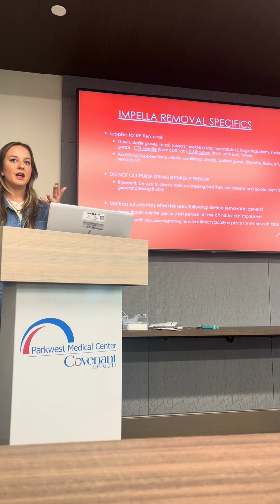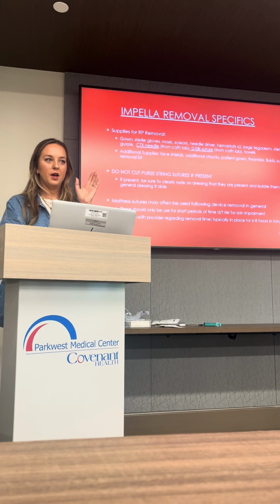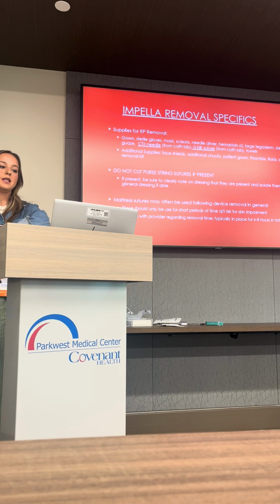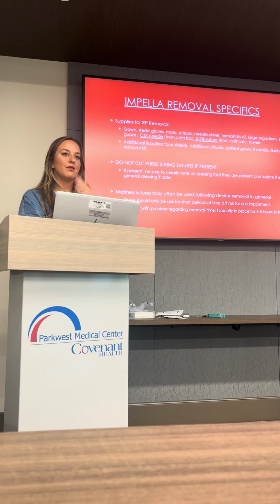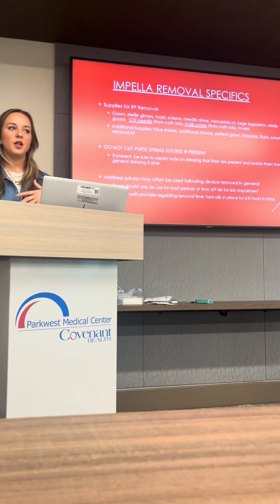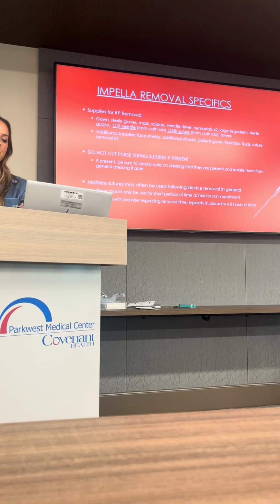It's good to have a good set of scissors. The scissors in the suture removal kit are not helpful, so general purpose scissors that are packaged by themselves are ideal. Two sets of hemostats, a large Tegaderm, sterile gauze. With the hemostats, it's nice for you to have ones that are clean or technically sterile. This is supposed to be as sterile of a procedure as possible. So the hemostats that you've been using on your IVs for the last 3 days that have been hanging on the hook over your sink are not necessarily ideal for this situation.